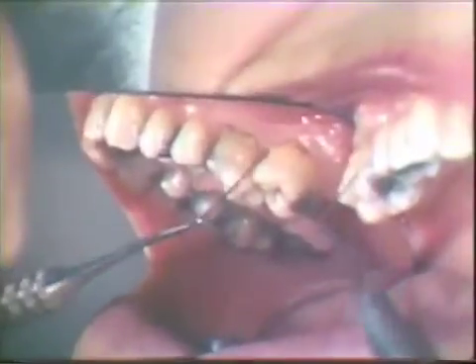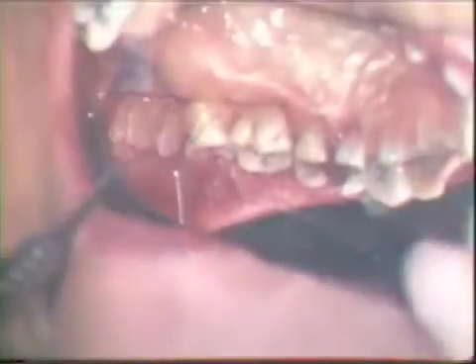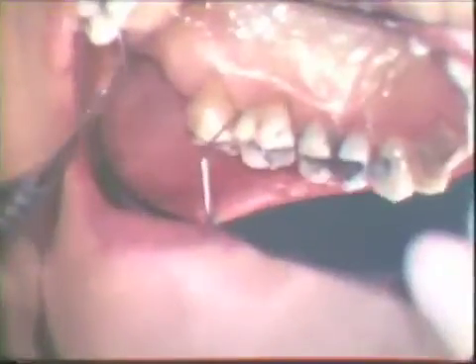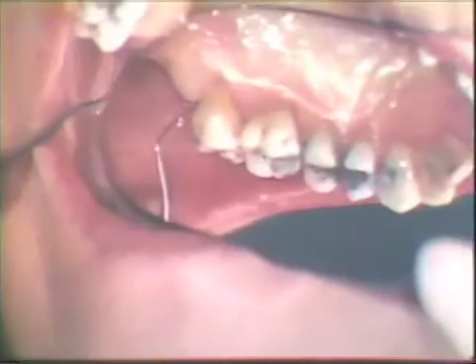The patient is a 68-year-old woman in good systemic health. The interproximal pockets are 4 to 5 millimeters deep, the buccal pockets 3 to 4 millimeters, and the distal pocket of the second molar is 6 millimeters. The interproximal palatal pockets between the molars measure 5 millimeters, and the distal palatal pocket of the second molar is 6 millimeters. The radiogram shows considerable horizontal bone loss around the second molar and slightly less bone loss around the first molar. The inadequate restorations were corrected prior to the surgery.